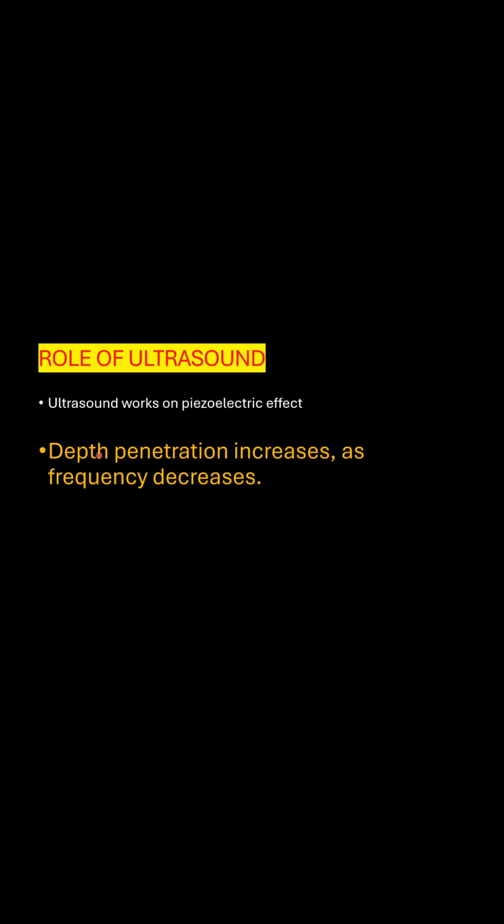Before we discuss any further, you should know two important rules of ultrasound. One, it works on the piezoelectric effect. And second, the depth of tissue penetration increases as the frequency decreases.